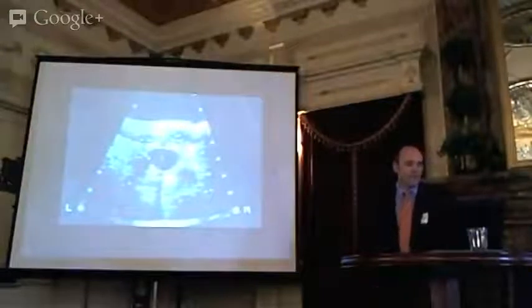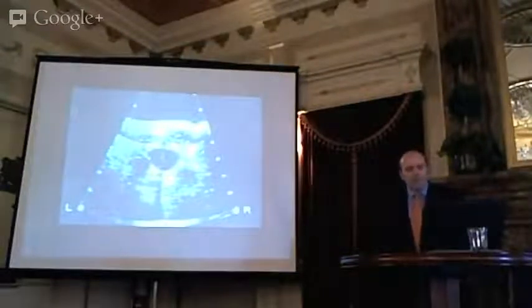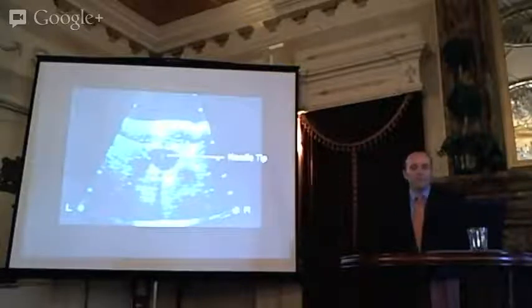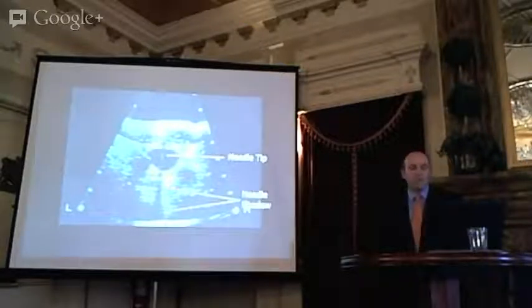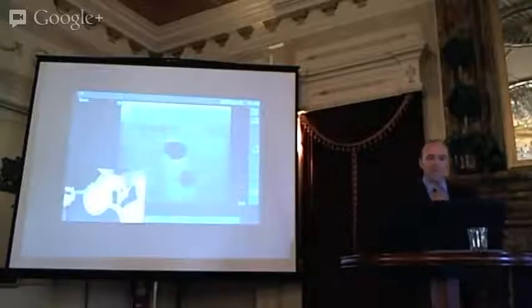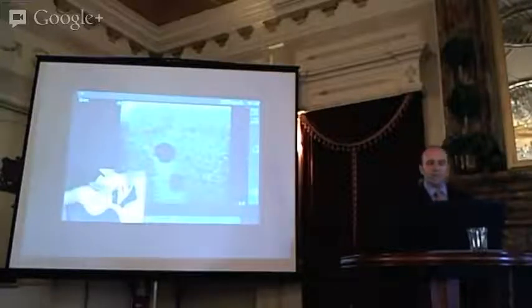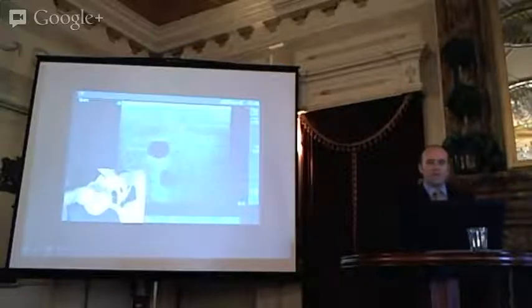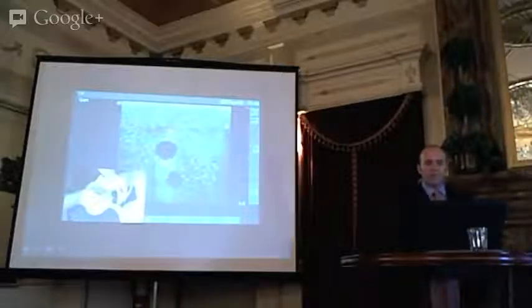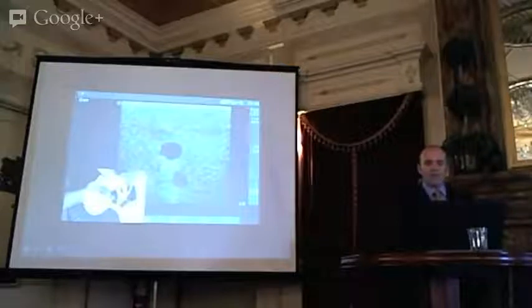This is an ancient, ancient image, gosh, from like 1989 or 90. And even here, we're usually mostly using a transverse approach. You can see the needle tip, the shadow, and we thought we were in this case, and it's not always what happens. Here is ideally how you do short axis approach. This is more simulating somebody that is not too familiar with it. You move your vein around, you adjust it, you put it straight in the middle of the screen. Ideally, you're close to it, now let's get that perfectly. And then you can drive your needle in.